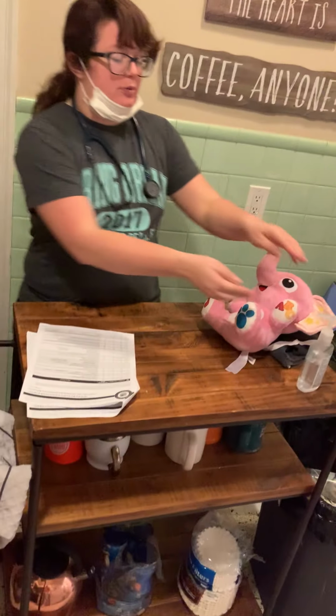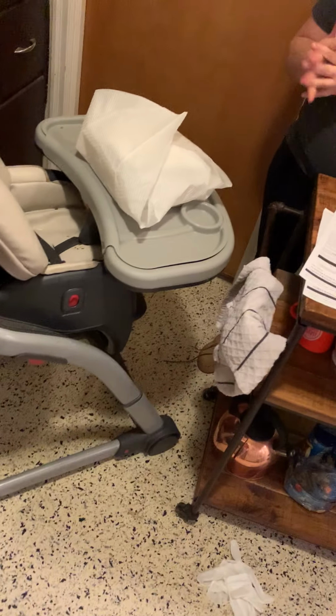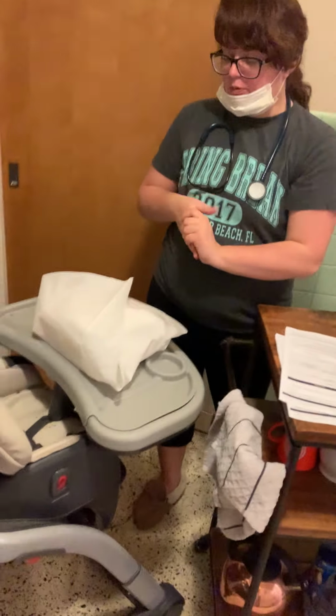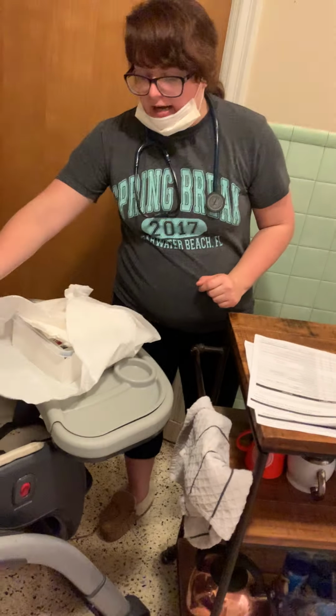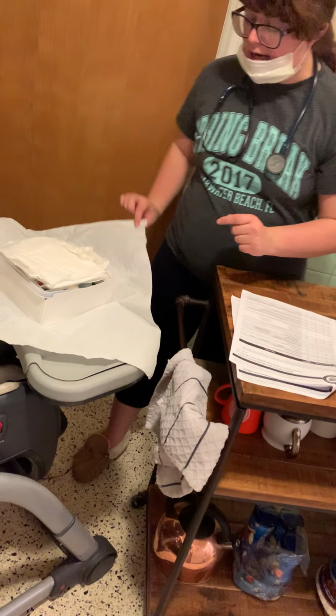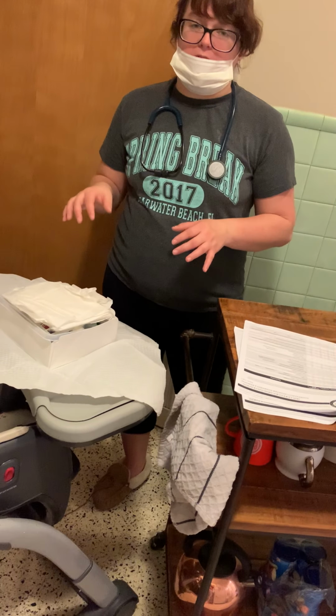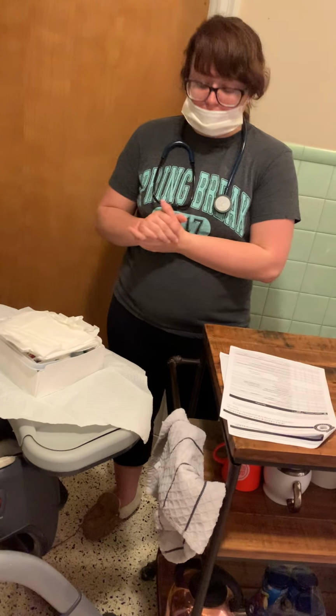And then I'm going to obtain my catheter kit and perform hand hygiene once again. My kit's right over here. All right. So first we're going to open it away from the body, side, side, and down. And the 1-inch border surrounding my kit is now considered non-sterile.